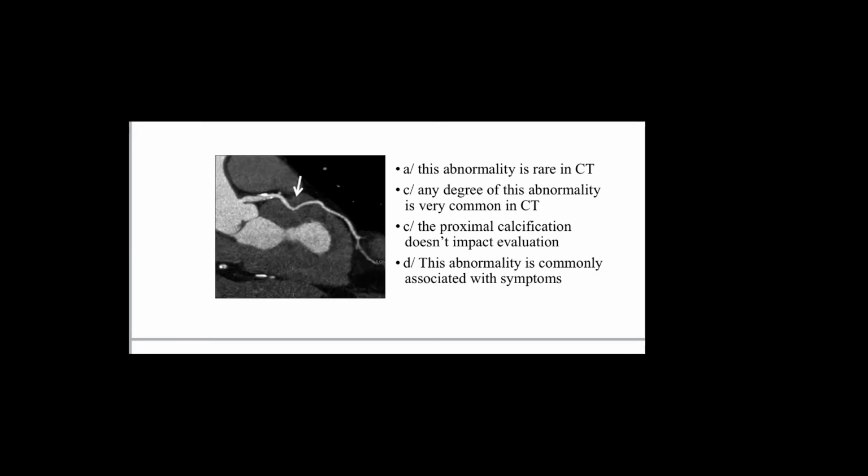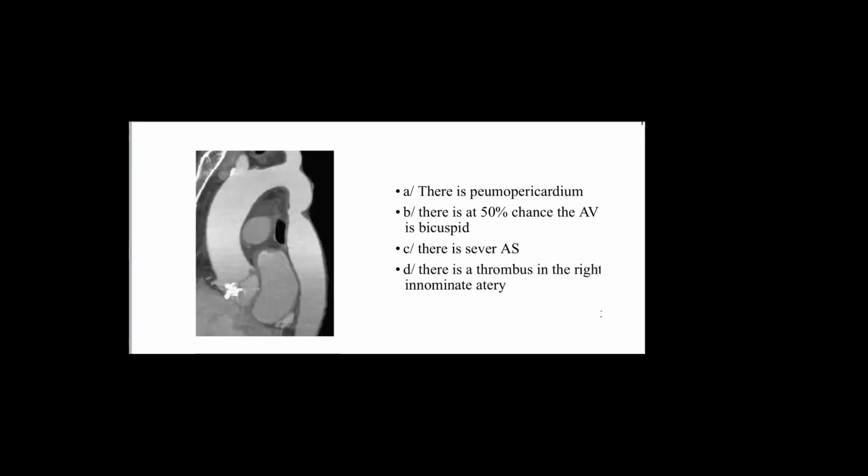The proximal calcification does not impact evaluation. No. Is this abnormality commonly associated with symptoms? No. It is not commonly associated. Exactly. It's commonly not associated with symptoms. Exactly.